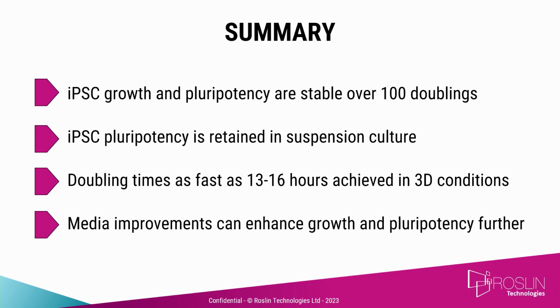You can't sustain a high cell density culture in an optimal state without following the tenets of spent media analysis and process design going forward.